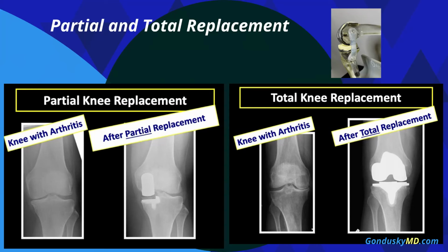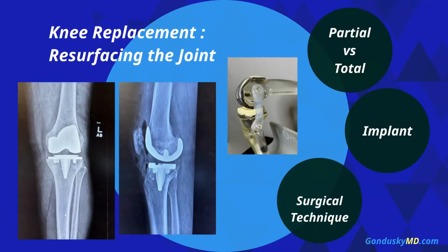But I do a lot of partial knee replacements. They're great surgeries for the right patient, but you do have to put a lot of thought into what's best for people in regard to these surgeries. Total knee replacement, which is a little more common than partial knee replacement, is pictured on the right, and that's what we talked about before, replacing the entirety of the knee joint, all three parts, including the kneecap, the femur, and the tibia.